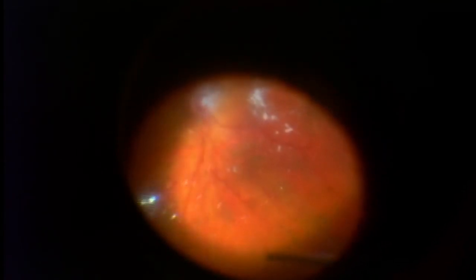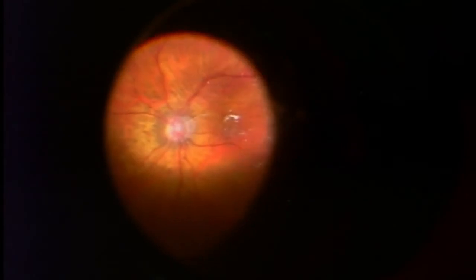Again, the appearance of the Kenalog is almost identical to the asteroid hyalosis. But you can tell now that some of the particles of the Kenalog are just kind of moving along the surface of the retina instead of being suspended like just a minute or two ago. This is a clear sign to me that the retinal surface no longer has vitreous attached to it.